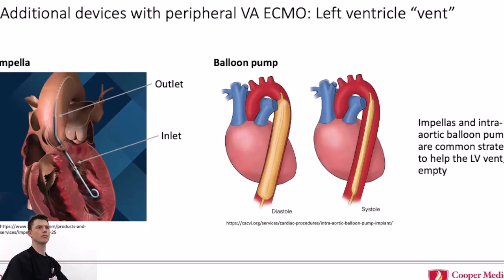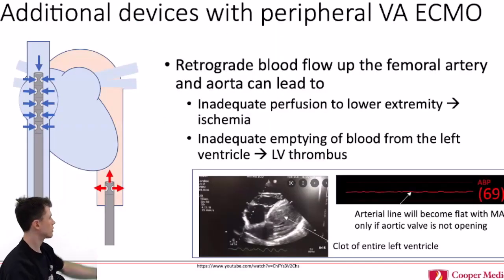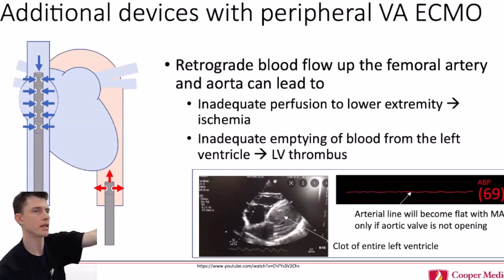Does the Impella necessarily have to be flowing higher than the circuit to compete against the retrograde flow? No. All you need to do is get the little amount of blood that's in there out of the ventricle from stagnating. Look at that blue on the drainage cannula. We're really trying to capture most of what's going to end up going into the right ventricle and then ultimately the left ventricle.